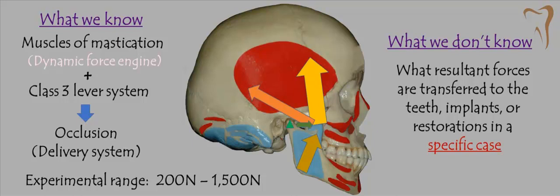And experimentally, there's a lot of studies that show an experimental range of somewhere between 200 and 1,500 newtons, which is a pretty wide range of force on the posterior teeth. That's what we're working with. The problem is that what we don't know, in any specific case that we're working on, is what are those parameters? What resultant forces are transmitted to the teeth, implants, and the restorations in any specific case?